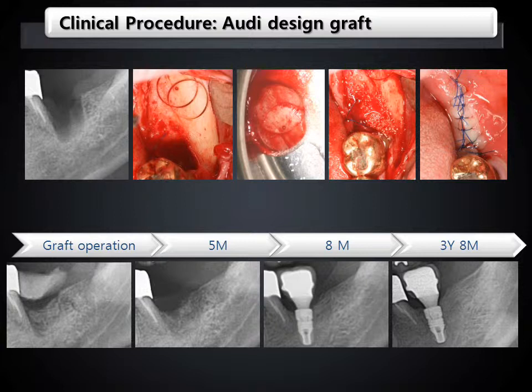On 3 years and 8 months after graft operation, the marginal bone was maintained. As a result, the defect of the donor site and recipient site were regenerated with the new bone.